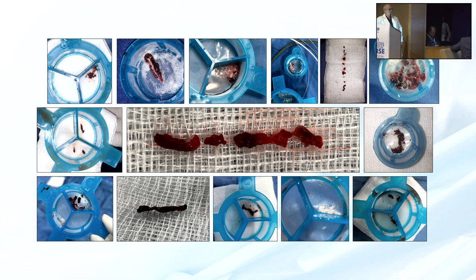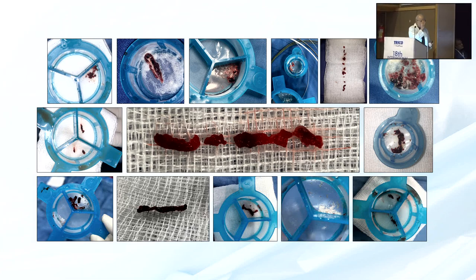Another interesting question is, this technique maybe works well in elastic arteries, and what about a calcified artery? What do you think? It's a good question, Avtandil. After doing maybe more than 100 of these type of deep intubations, now I again go by the tactile feel. So beginners should refrain from doing this till you have achieved a good amount of experience with regular interventions and complex interventions.